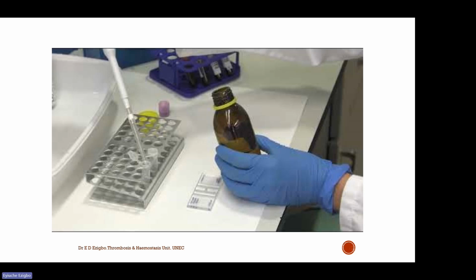You can see the manual method using the microscope. This is just for one patient you are counting, or you can put two if you're an expert.